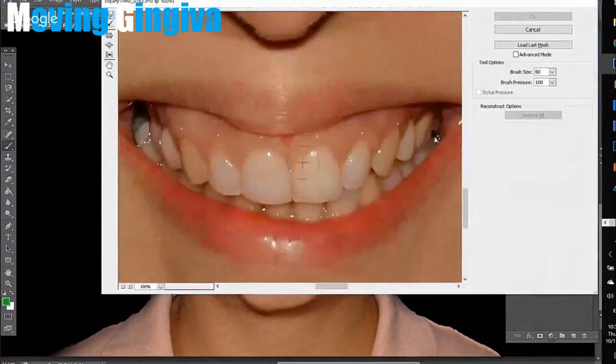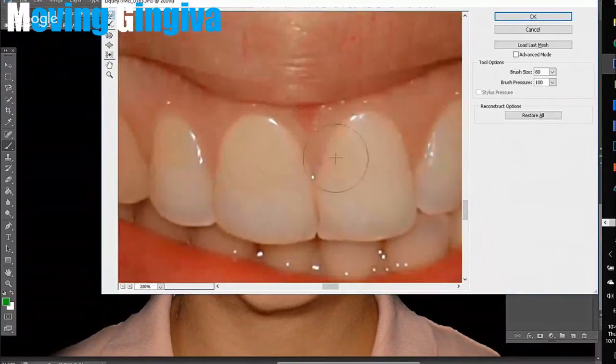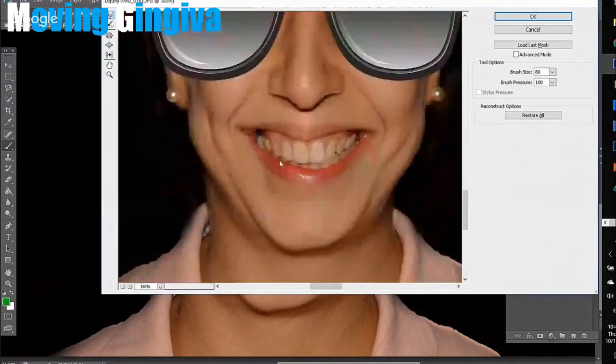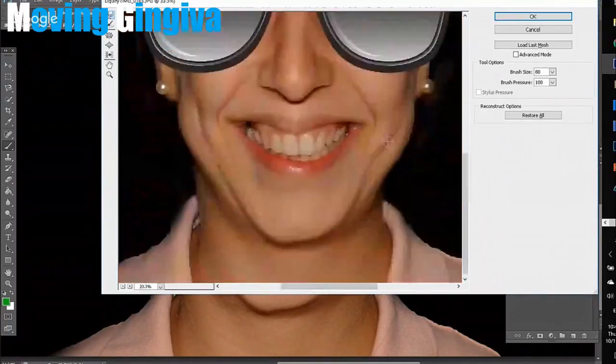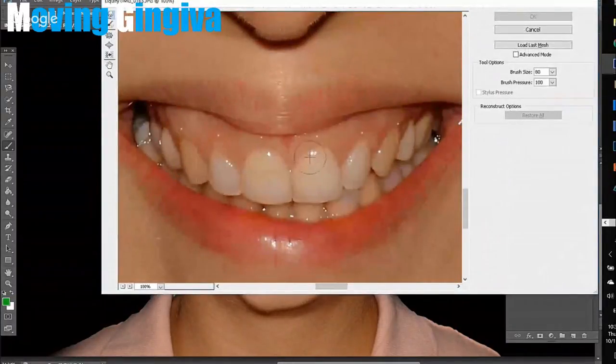Because the traditional method would be getting those templates and putting them on top of the teeth and the gingiva to simulate a gingivectomy, which again does not resemble reality. So what is the use of a technique which you utilize to simulate reality when in reality you are going to perform something completely else?